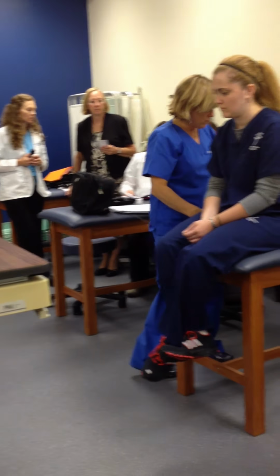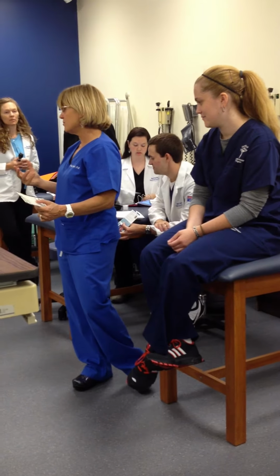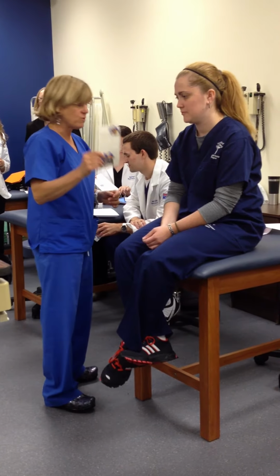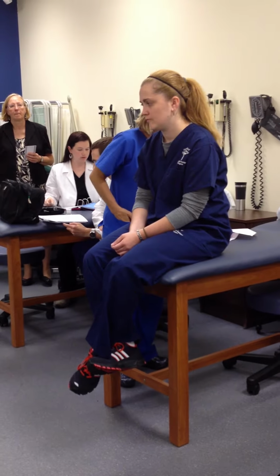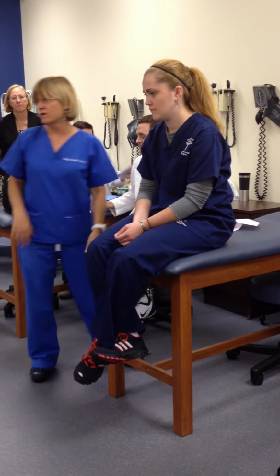Okay. So that's our vision card, and we want to do vision before we start shining lights in people's eyes, because if you do your fundoscopic exam first, they're seeing white dots. So we want to do our vision card first, and then we're going to do the visual fields by confrontation, a minimum of 4 each side.